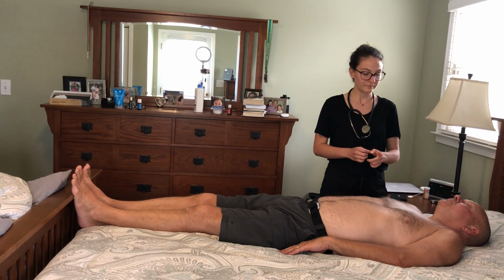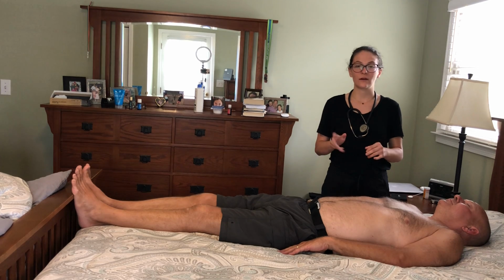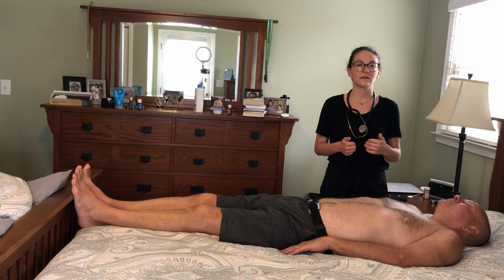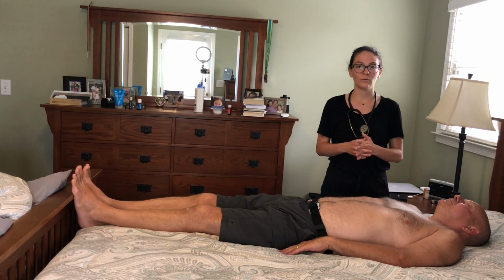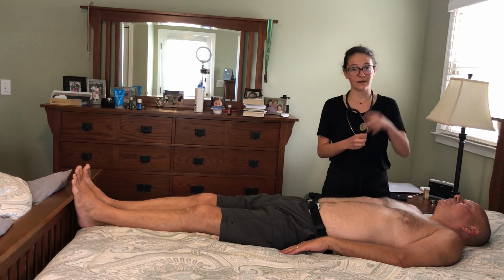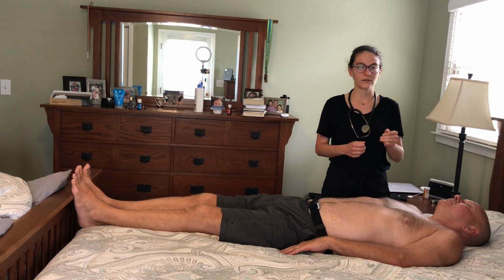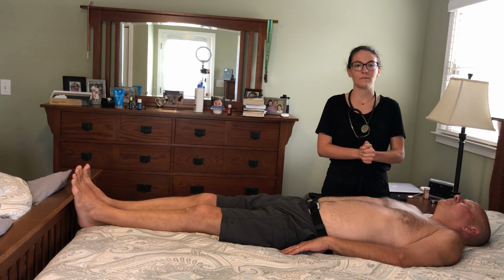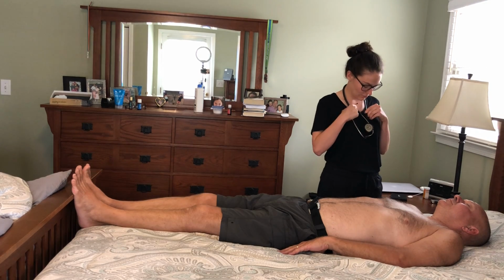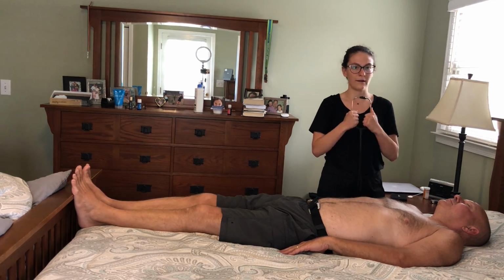The tricuspid valve is located at the 4th or 5th intercostal space to the left of the sternal border, and the mitral valve is located at the 5th intercostal space under the mid-clavicular line. So right now I'm going to go ahead and auscultate for those 4 areas.